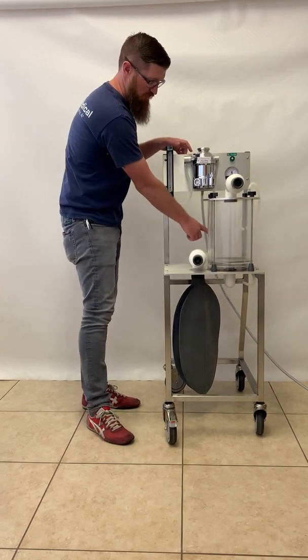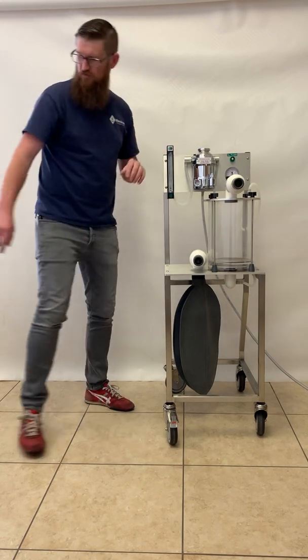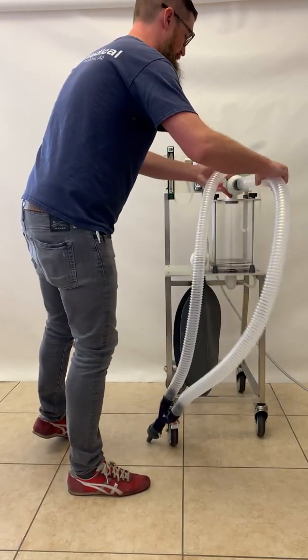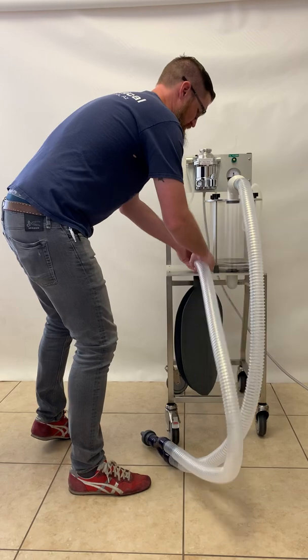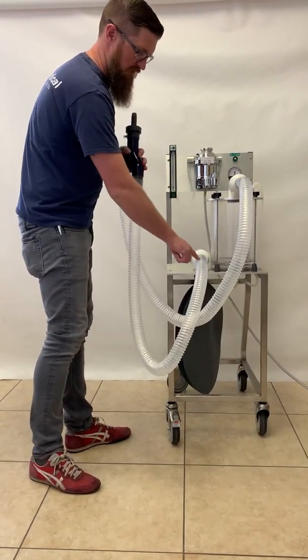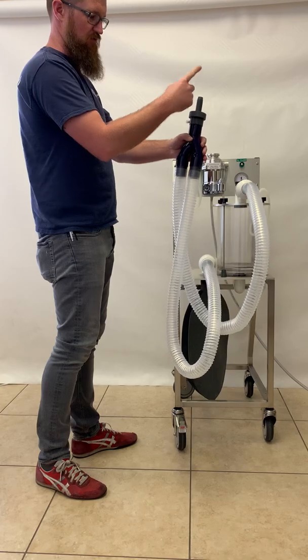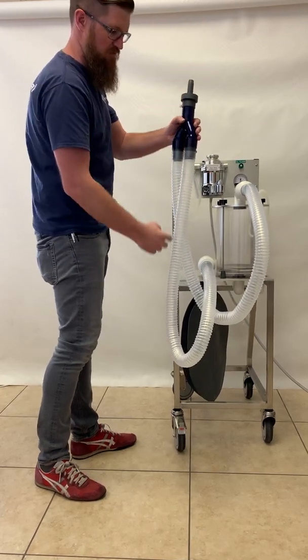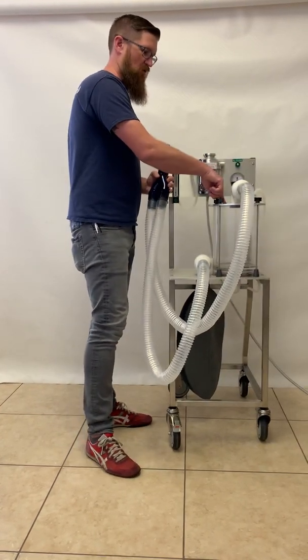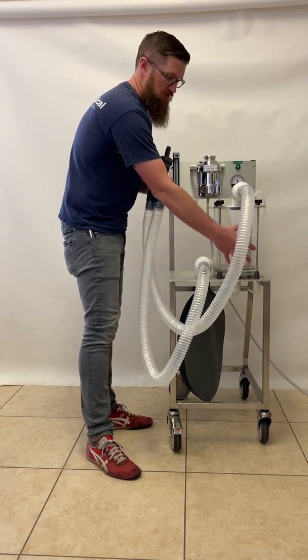That fresh gas will come through the inspiratory valve to the patient and through the patient hose, which connects to both valves. The fresh gas comes out to the patient, to the Y-piece, and to the endotracheal tube. When they exhale, it comes back out through the expiratory hose and through the expiratory valve into the absorber, which is filled with soda lime granules to absorb the CO2.